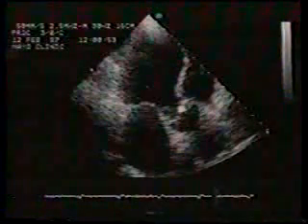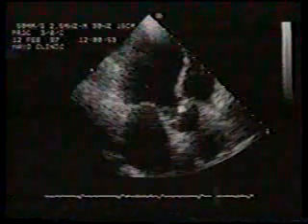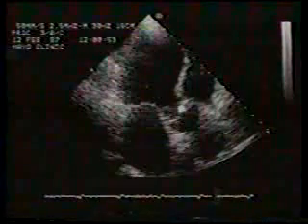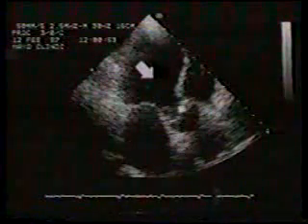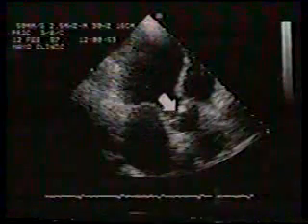This patient has severe reduction in left ventricular function secondary to ischemic heart disease. This is an apical long axis view. Both the left ventricle and left atrium are enlarged, and the aortic valve is mildly calcified.